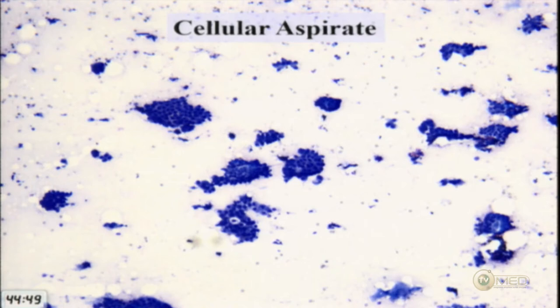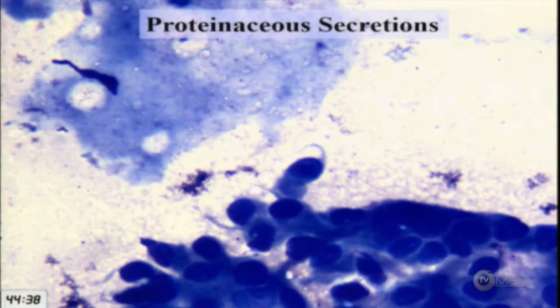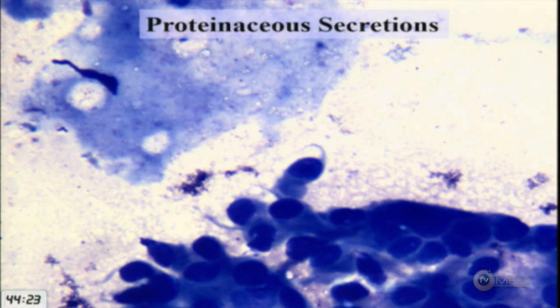The aspirate is fairly cellular, with cohesive groups of cells and scattered single cells in the background. There is also some proteinaceous secretory material in the background, and we can see little curly-Q tails on some of the cells — a strange finding we don't usually see in salivary gland tumors.